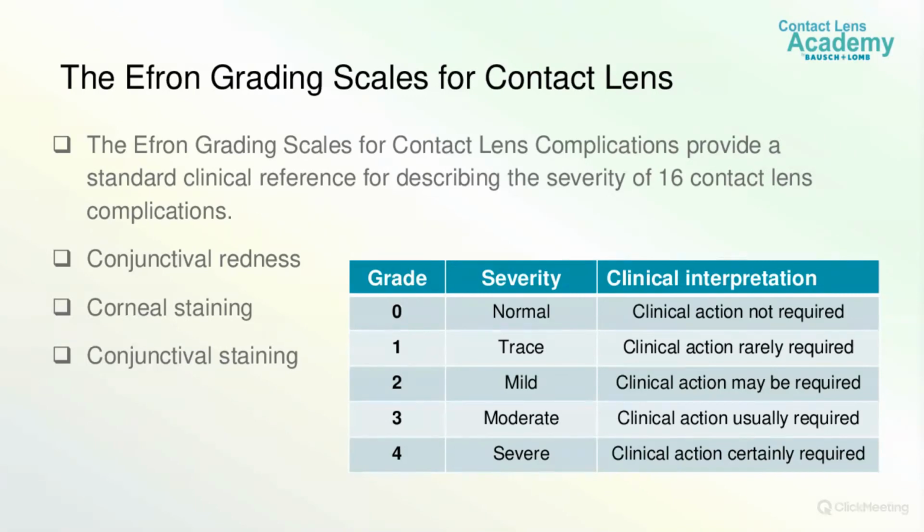You can use the Efron grading scale in your clinical practice for contact lens complications.